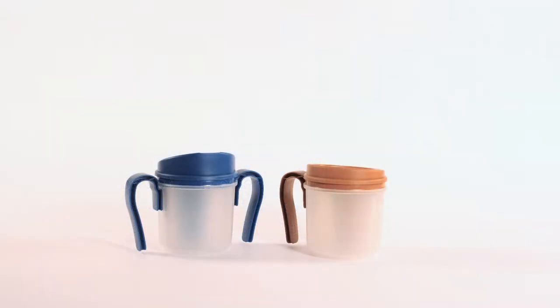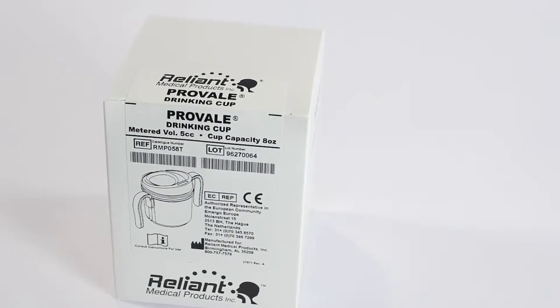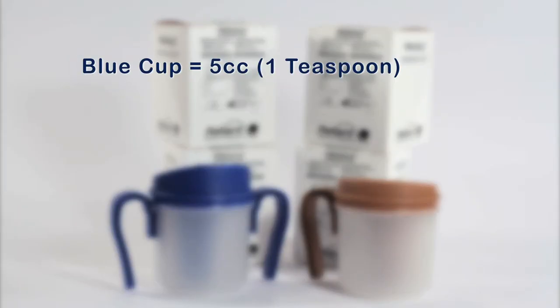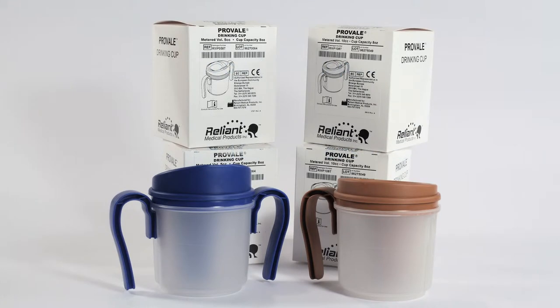The ProVail Cup can be purchased in two delivery sizes, each designed to dispense a predetermined volume of thin liquid: 5 cc (1 teaspoon) or 10 cc (2 teaspoons). The blue cup delivers 5 cc (1 teaspoon) and the brown cup delivers 10 cc (2 teaspoons). This video will familiarize you with the ProVail Cup and demonstrate recommendations on how to assemble, fill, and refill the cup.